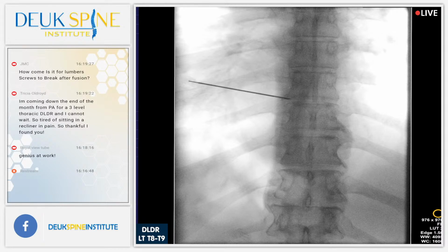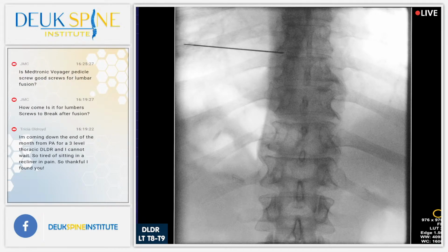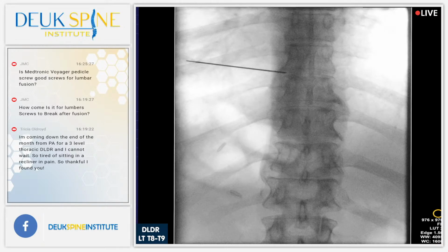Come on, take a picture. All right, so a little bit higher, go north by 1/2 inch. Shot. So let's count. Pedicle of 12, 12, 11, 10, 9, 8. We're between 8 and 9. That's the 8-9 disc. I agree.